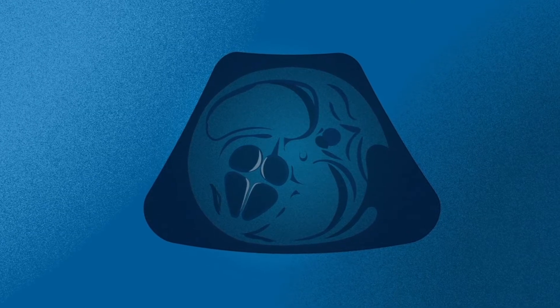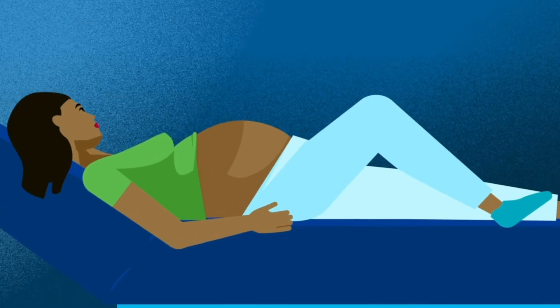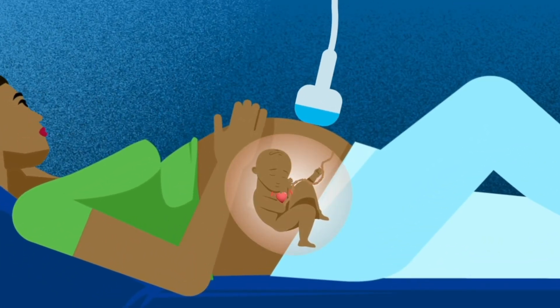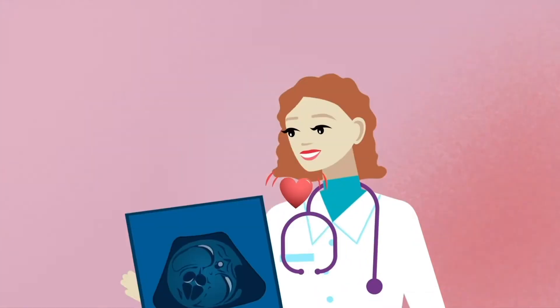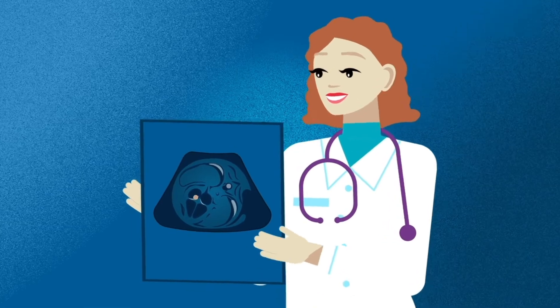A fetal echocardiogram uses sound waves to create pictures of your unborn baby's heart. These pictures let the fetal cardiologist see most of the structures inside and around your baby's heart.